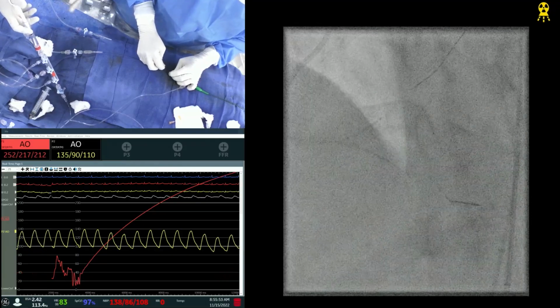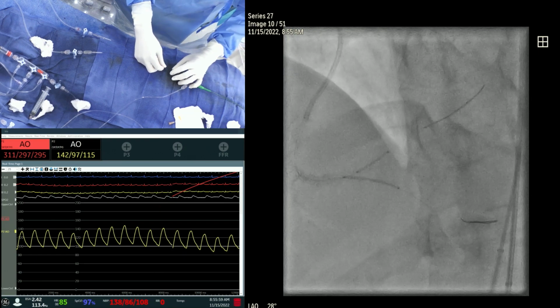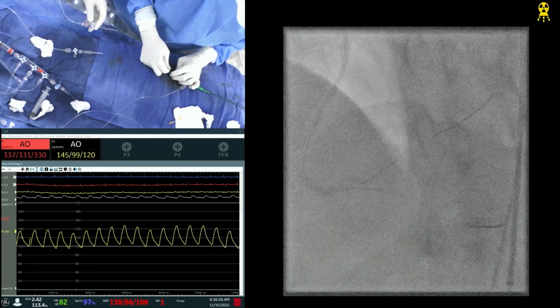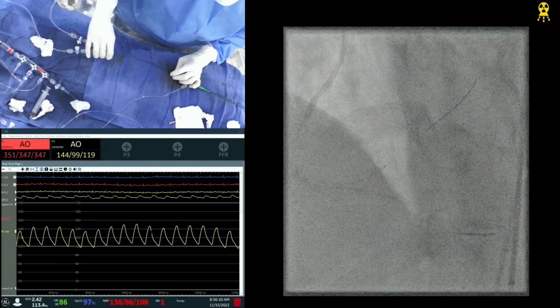Okay. Okay, just let's take a picture. Looks good here. Yeah, AV wants to bring back 1 millimeter, that's okay. But otherwise it's okay also because we will open the kissing anyway. Good. Wait. I'm breaking the AV now. That's AV. Yep, going up. This is the PDA. Yeah, go up with the AV. Okay, good.